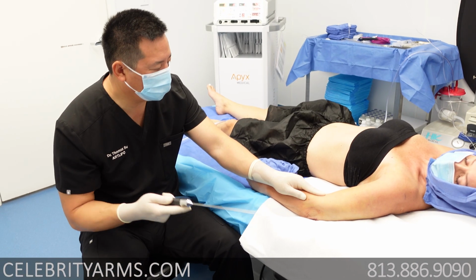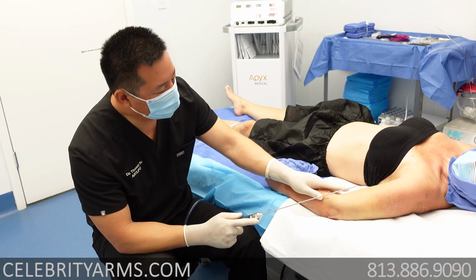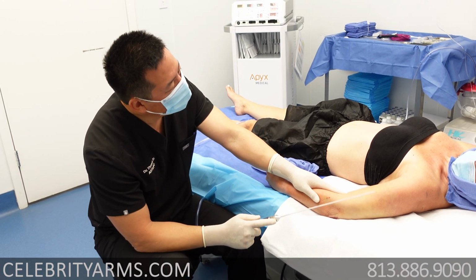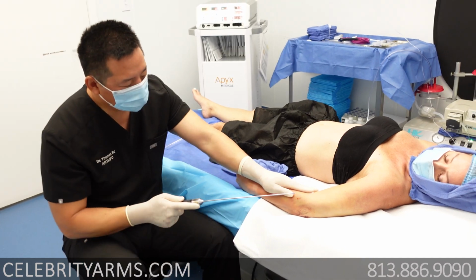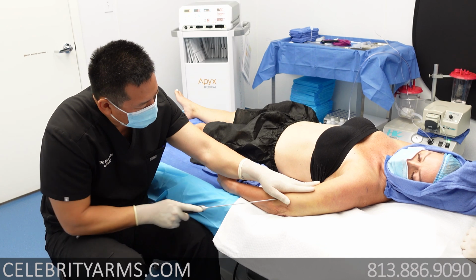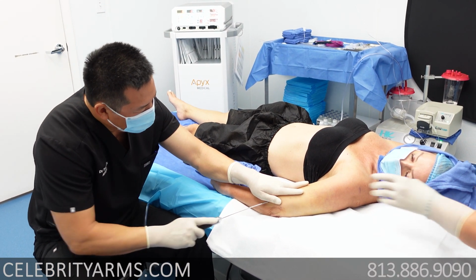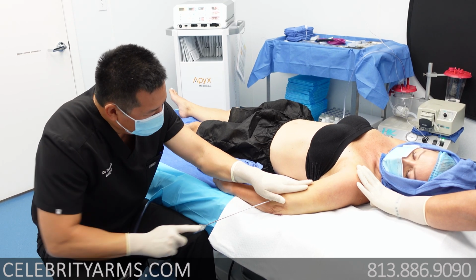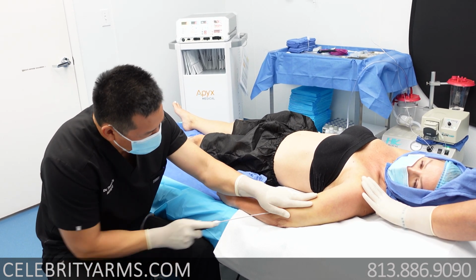Okay, so we've got everything numbed up. We call that tumescence, and we've got everything tumesced with our anesthetic fluid. And Lisa's been doing really well, as she told you earlier. So here we're going to start. Okay, so I've got her tensed up. You just hold it right there. And this is what lipo looks like in our clinic. I feel nothing.